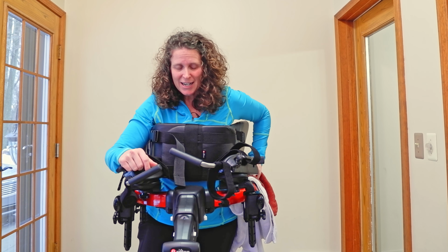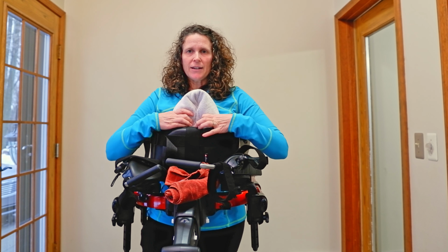What I do is take a towel. This is just a hand towel, and this might be enough. Or you could use a regular towel, fold it in half. I'm going to roll it up, and I just fold it so it looks like a rainbow. If my individual is already in the pacer, what I would do is maybe loosen up the back and just kind of drop them back into that. You might even need to open up the front of the chest prompt a little bit, but open up the back, lean them back, tuck them forward, and then you have this nice little shelf that's right here, and you can adjust the height of it.